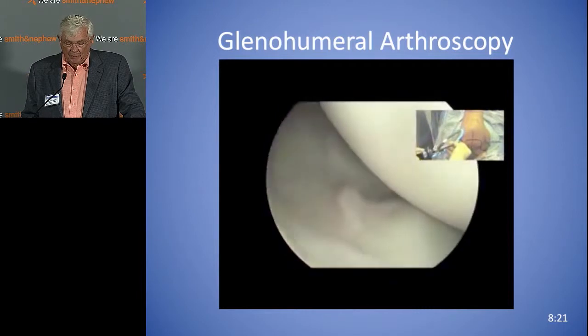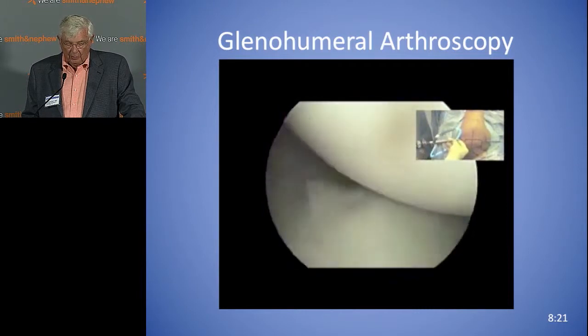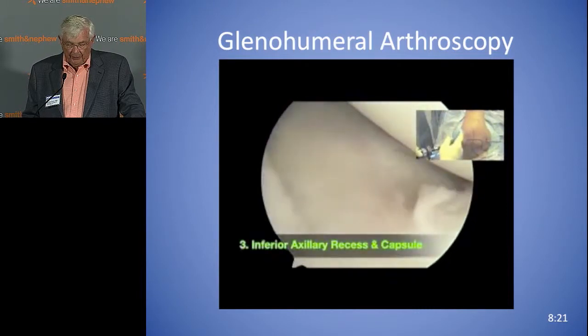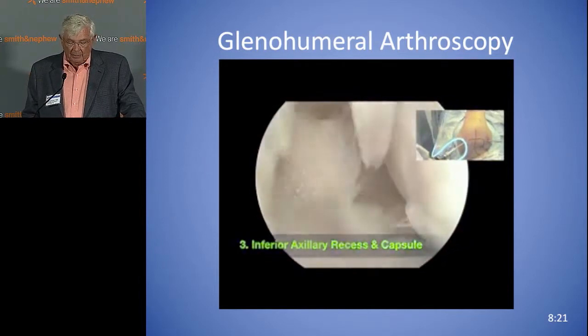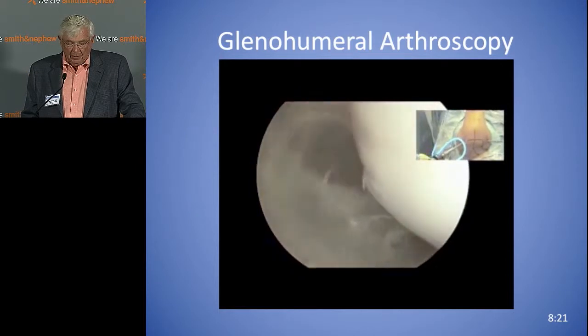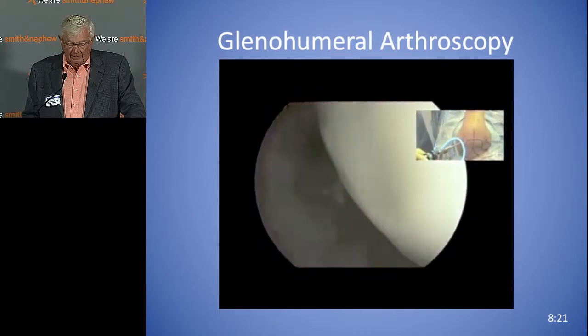Now we're moving into the axillary pouch. You can look at the inferior labrum, and then you can rotate the scope up to look at the axillary recess and see if there are any loose bodies down in that area.